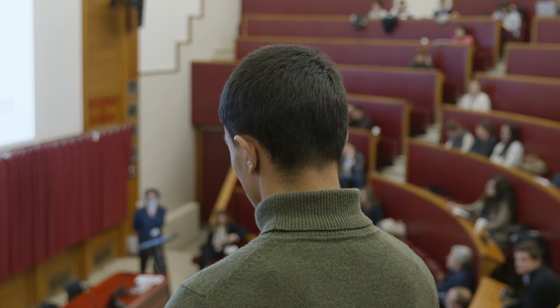Thank you. For the first question, we did not try logistic regression because it has been well proven for a bit more than 10 years that convolutional networks outperform any other machine learning algorithm on computer vision. Every year there are competitions, and this kind of model usually outperforms logistic regression.